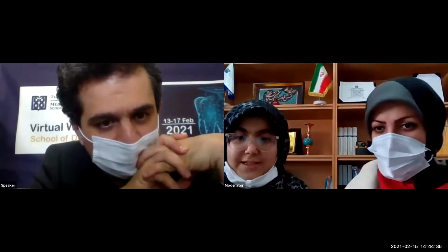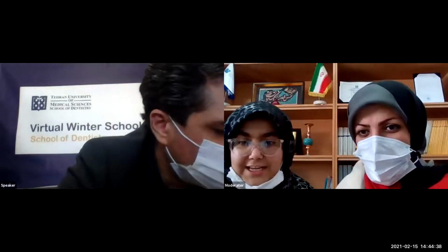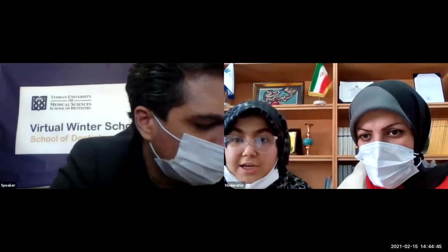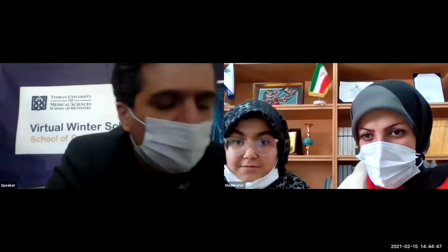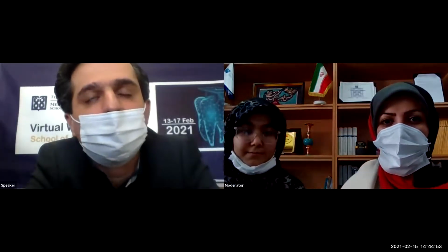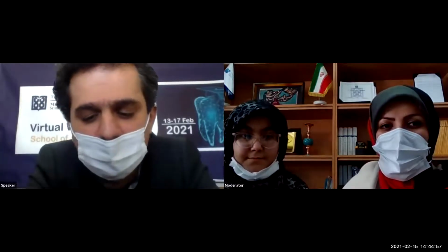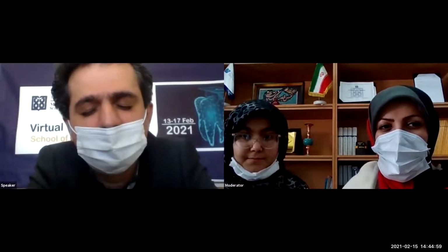And there is something else. Some books say that while we are determining the color, you need the sun. What do you say about that? Sun, because we have a natural light. In the clinic, we can make the natural light by a lamp of about 5,500 degrees Kelvin.